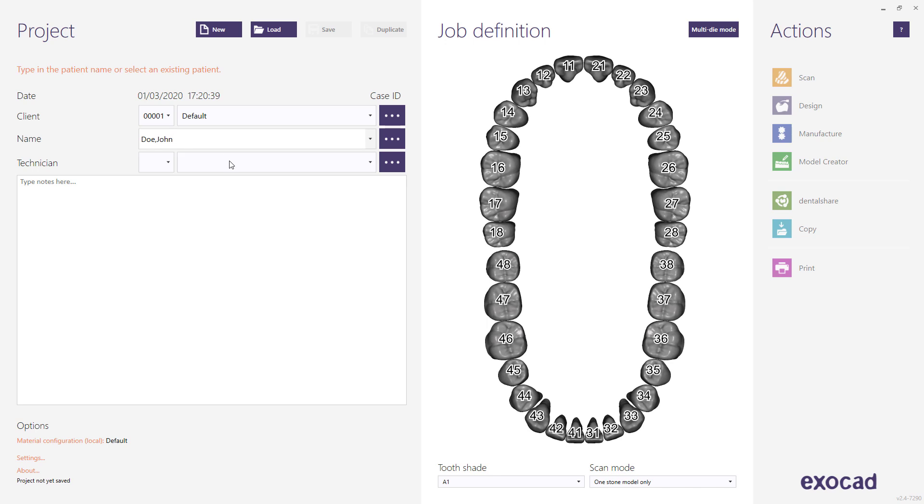Select the technician the same way as you selected the client. The technician field is not mandatory.